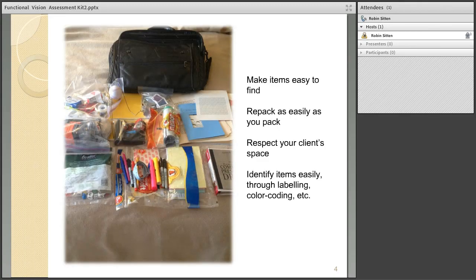Here's the bag fully unpacked. We'll look at each of these items as we go through the presentation. You can see the individual plastic bag groups here. I reuse a lot of large plastic bags when I come across them. Tortillas come in nice large packages, so do coffee filters. They zip closed, and if you pack them right, can fold over on themselves pretty easily. You can also use freezer bags. Of course, they usually have labels and are durable plastic.